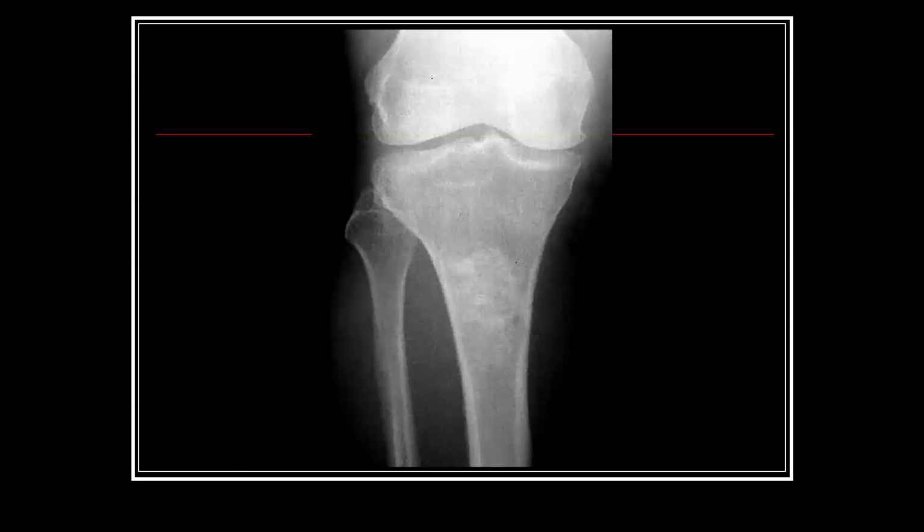So what might one of these look like? Well, here's an example, sort of an osteoblastic process, not particularly aggressive looking margins, not well defined.